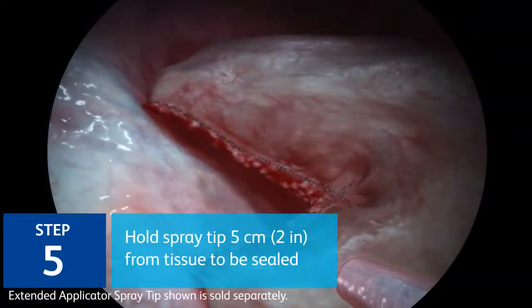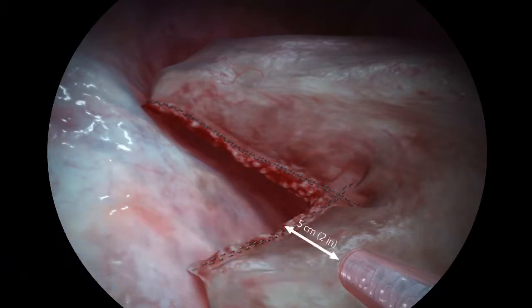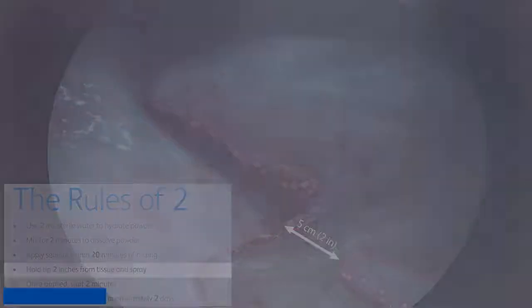Step 5. Keep the applicator tip approximately 5 centimeters or 2 inches away from the target area during application to avoid creating bubbles in the sealant material. The formation of bubbles may compromise the adherence and mechanical properties of the sealant.